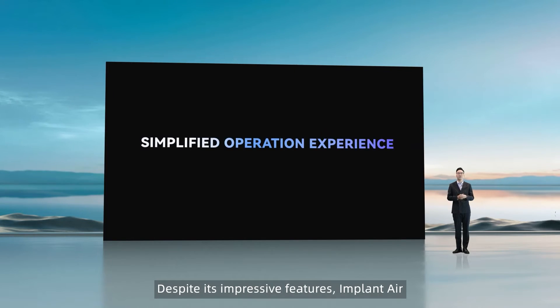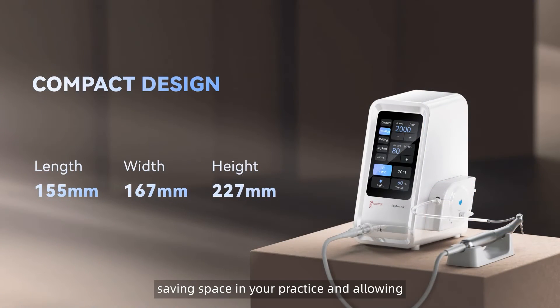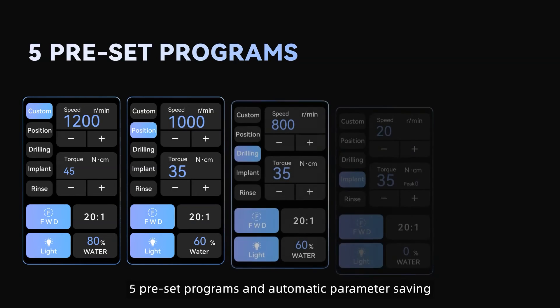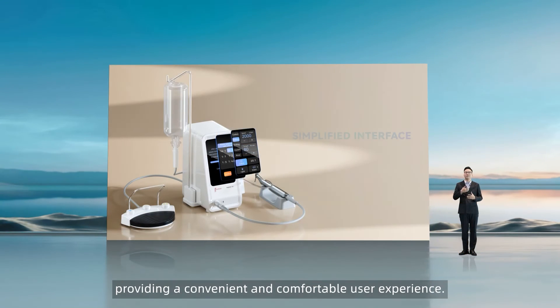Despite its impressive features, ImplantAir is compact and portable, saving space in your practice and allowing for easy transport. The streamlined interface includes 5 preset programs and automatic parameter saving after each operation, providing a convenient and comfortable user experience.